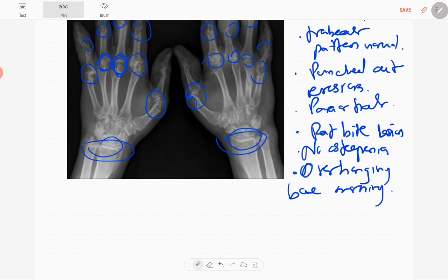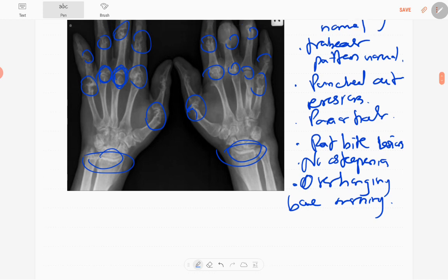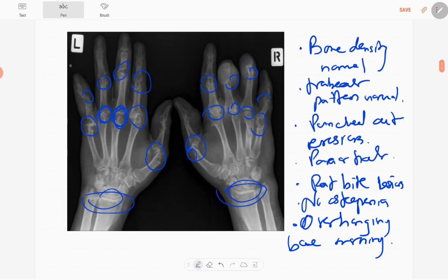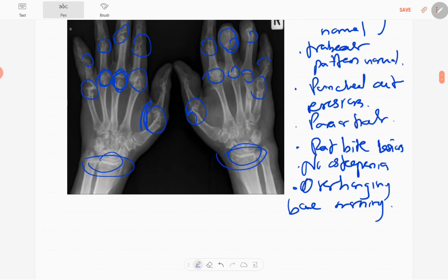The overhanging bone margin is due to sclerosis of the residual affected bone. You can also see soft tissue swelling around the joints. Multiple small joints are affected in this case.